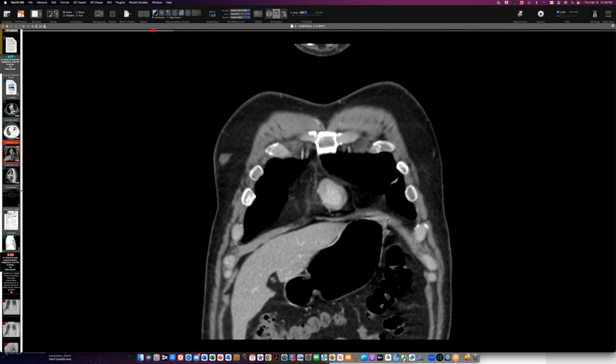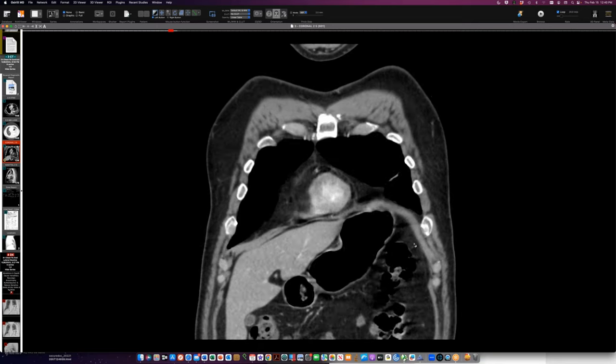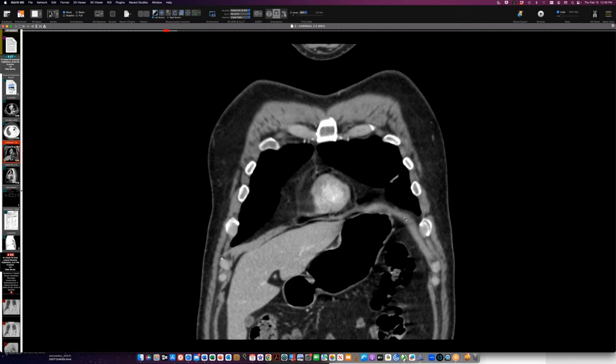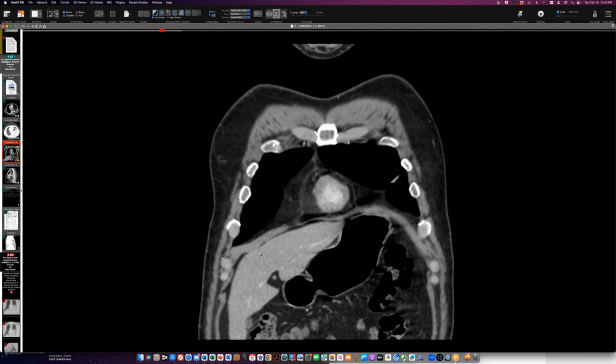It's possible that if we get a new CT scan now we would see atrophy on this side. This diaphragm muscle thickness is okay anteriorly, but the muscle doesn't look normal — it's speckled with fuzzy margins. I think it's edematous. I don't think it's healthy muscle.